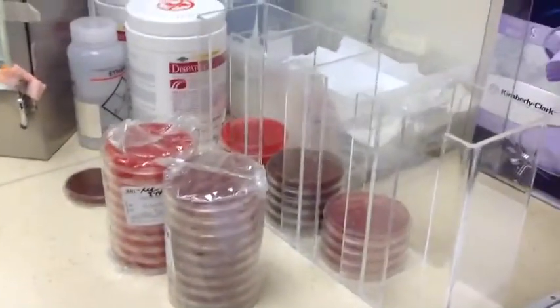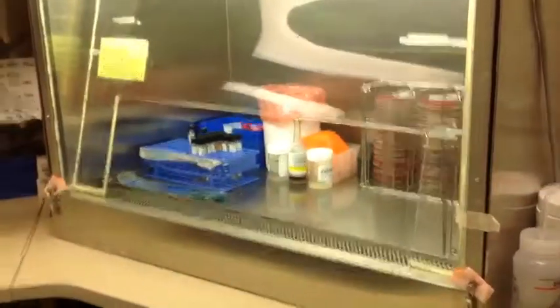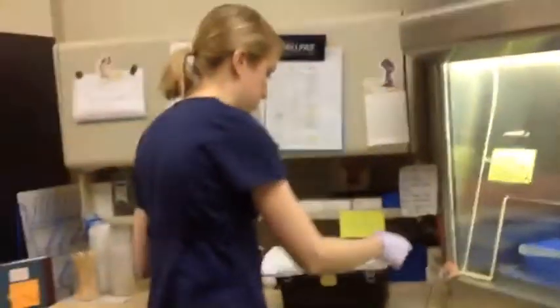And then lastly, we have microbiology back here. This is where we actually grow bacteria. And we actually ID it, and then we have different sensitivities for the different types of antibiotics so the doctor knows how we can actually kill the bacteria.